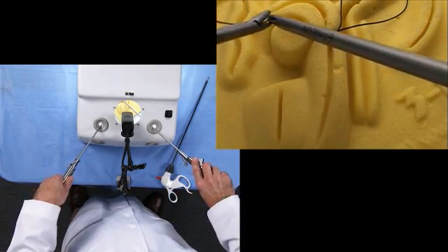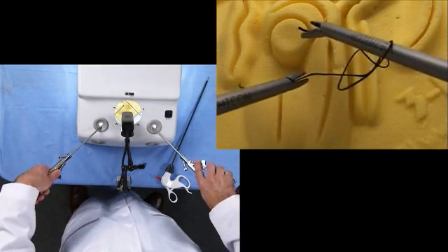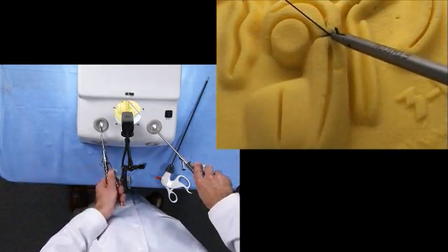We'll rotate hands, suture's coming back to us, needle's to the left of the needle driver, camel's hump, and we'll tie that down.